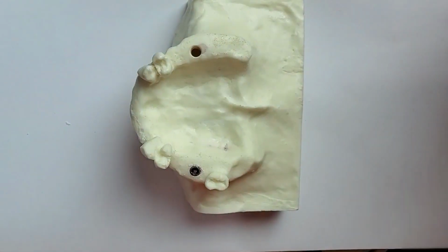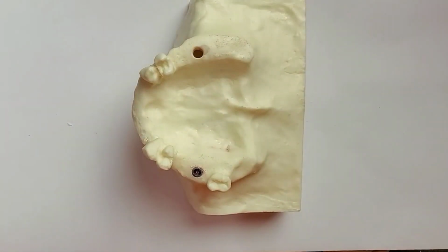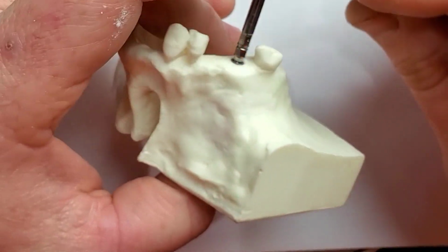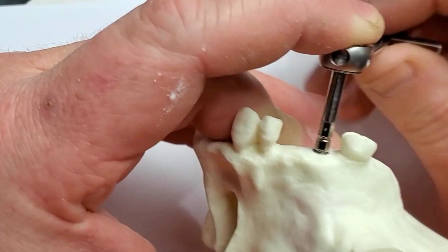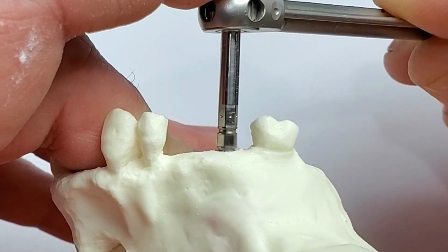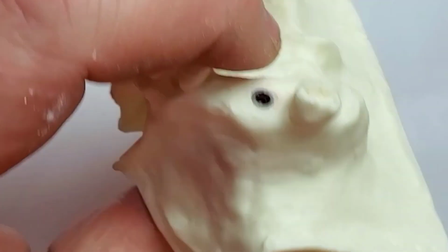If by chance you needed to adjust your timing, your degree of rotation, again, don't try to do that with the guide in place. You only want to crank far enough that that stopper touches, and then quit cranking with the guided driver. If I needed to adjust the timing, maybe to put a flat to the buccal, at that point I would just grab a normal freehand implant driver and just put the final turn on this. So if I want a flat to the buccal, we can turn this about another 20 degrees, and there we go. And that's the completion of the procedure.